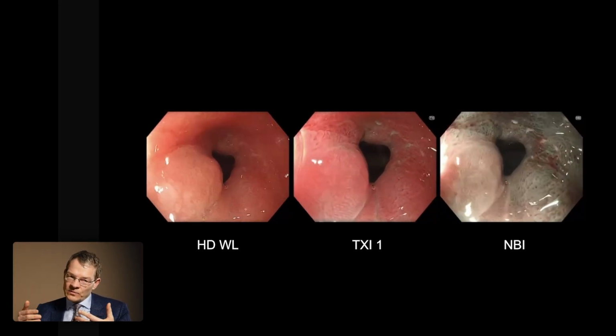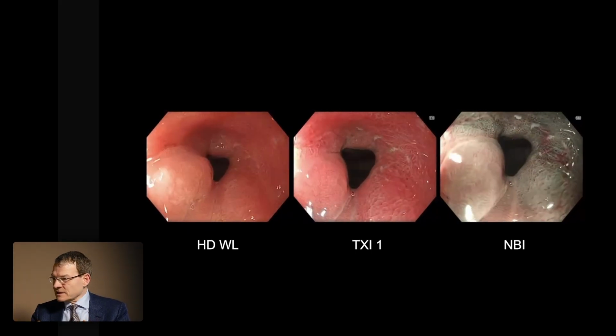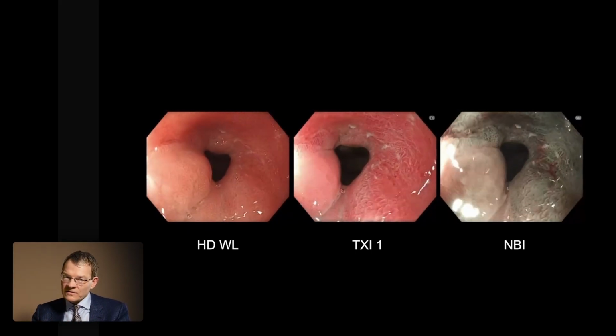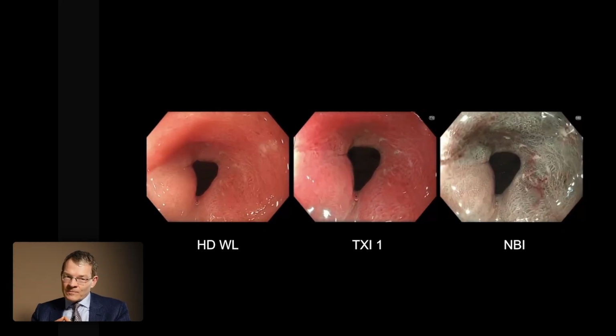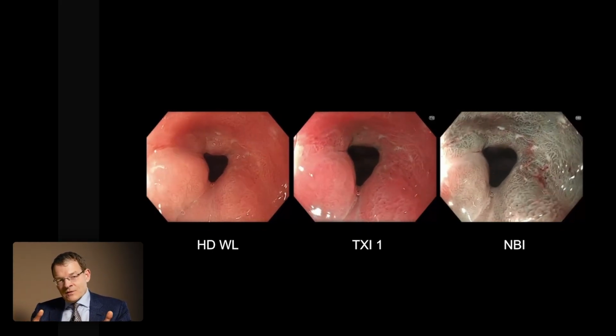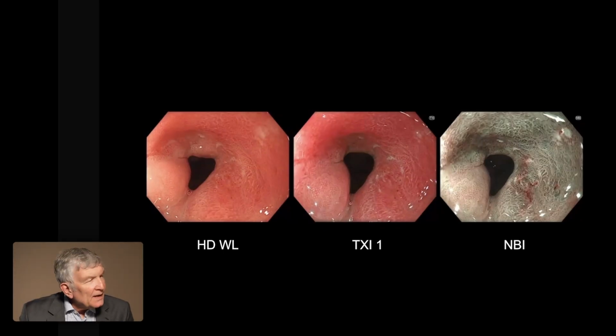And then it is always the point that NBI we somehow use for better classification, because we especially focus on the vessels. I think you need both filters, definitely, but we have definitely more information than only with the regular white light. So for clinical application, we have to find out what's the best sequence and whether the detection accuracy goes up, but it's interesting to see those pictures.